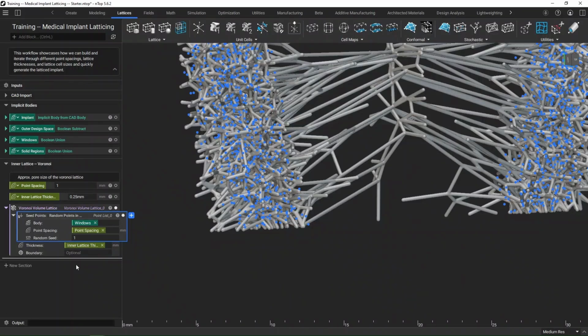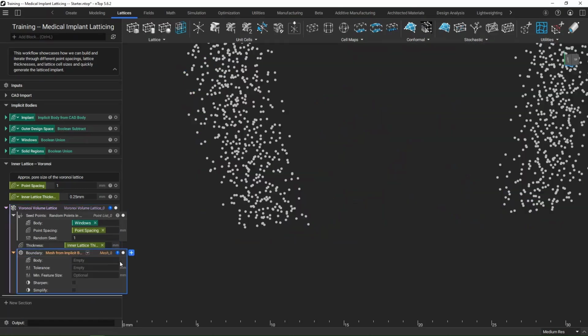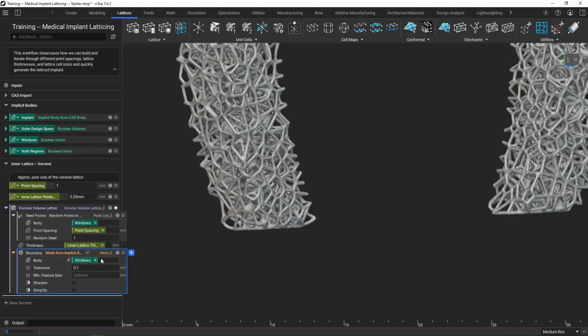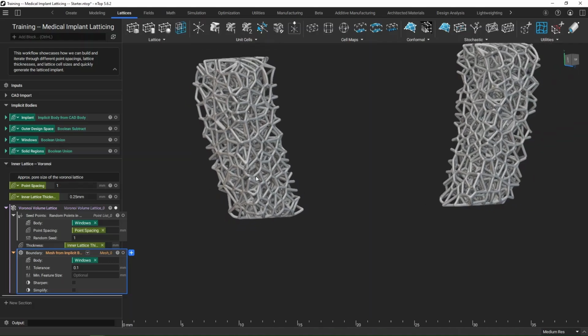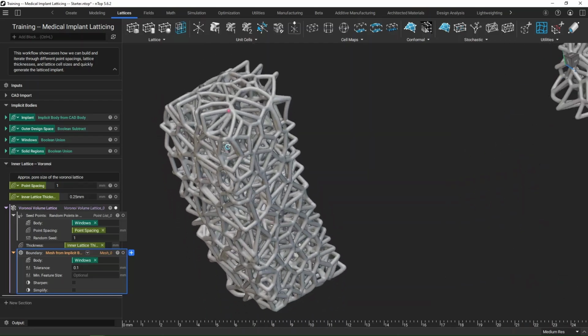And the way that we can do this is by adding this optional boundary. By this little icon, we can see that it's asking for a mesh. So I'm going to go in here, just go mesh from implicit body because I know that I have that implicit window region here. I'm going to drag in that body. Maybe my tolerance just can be 0.1. Doesn't have to be anything too fancy because we're just grabbing onto it so that we can have that outer volume. But right away, you can see our block has run and we've got it nice and enclosed from there.